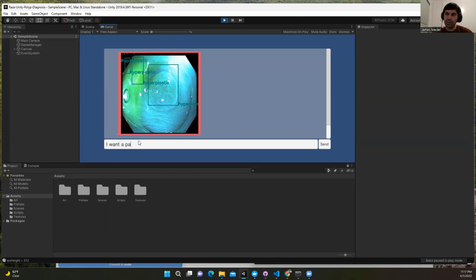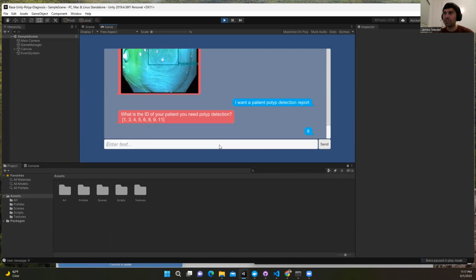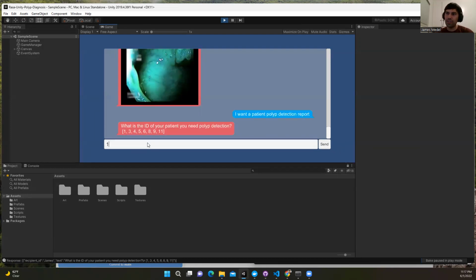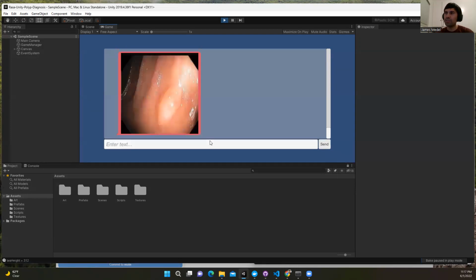Let's do one more. I want a patient polyp detection report. Okay, and so what we can say is we can do a 9. So nothing. Let's do one more. Polyp detection report. And this is where I was talking about too, we need to further train the YOLO detection model.